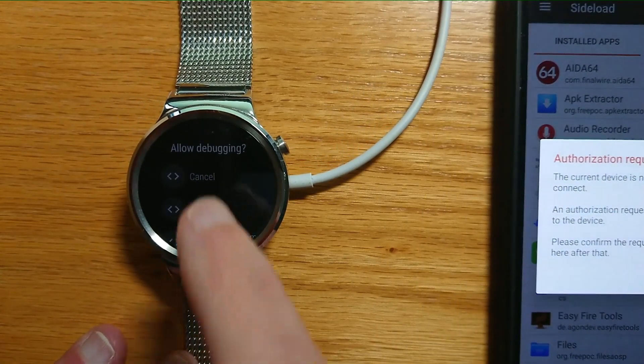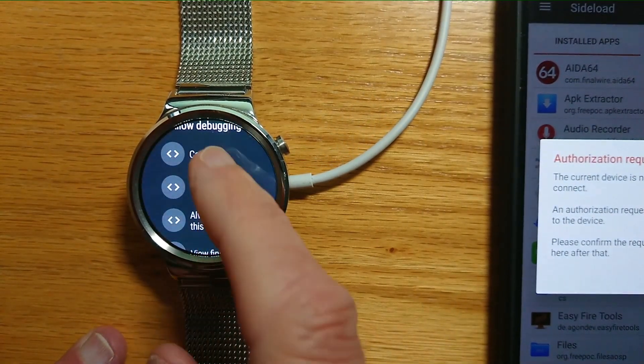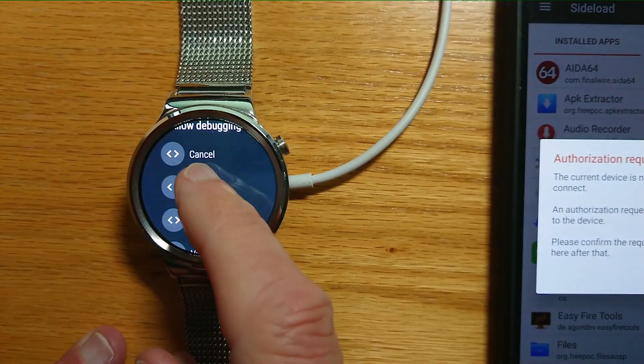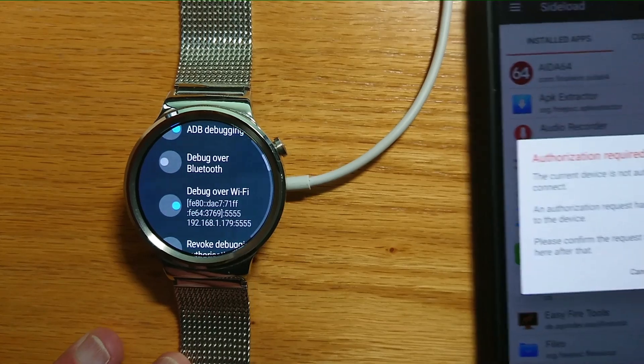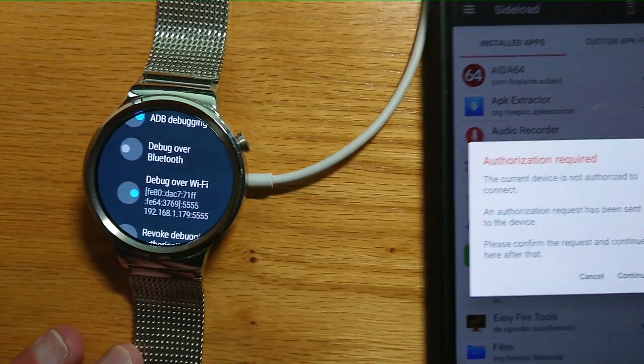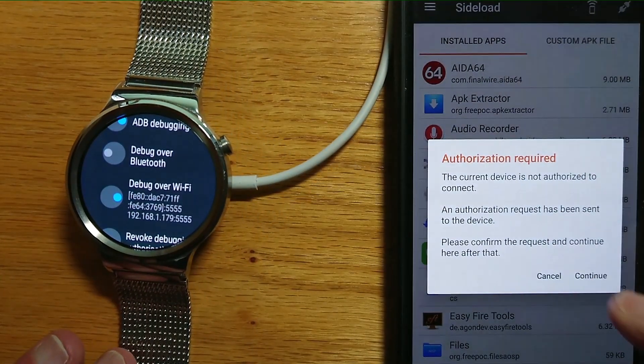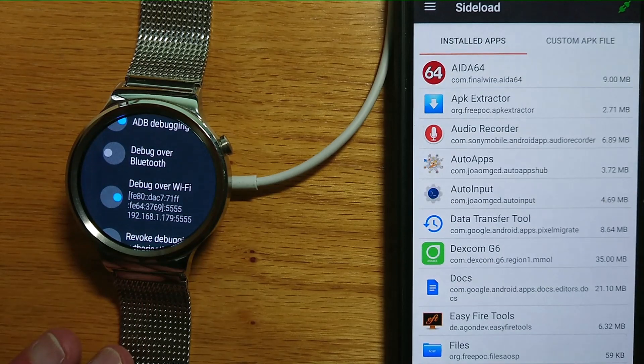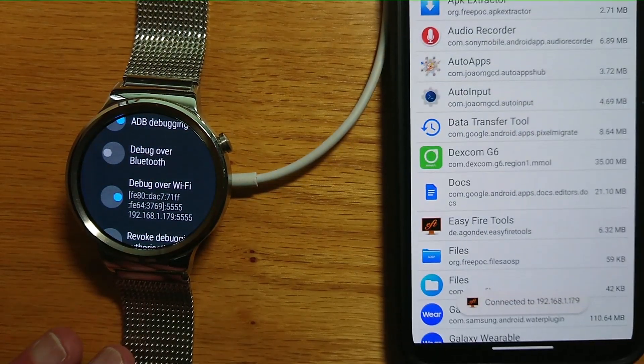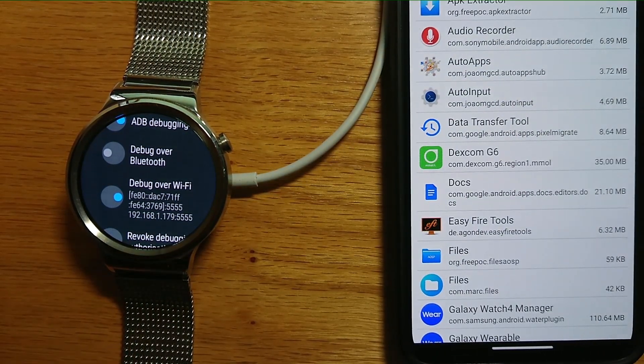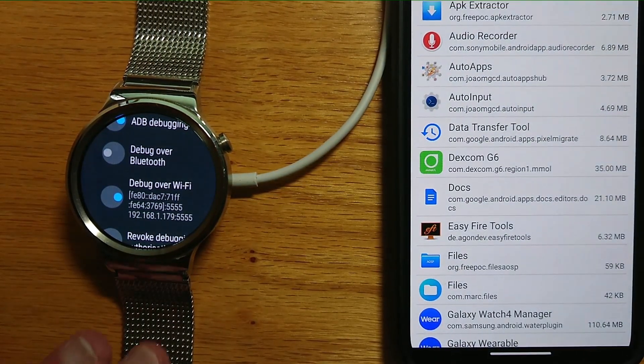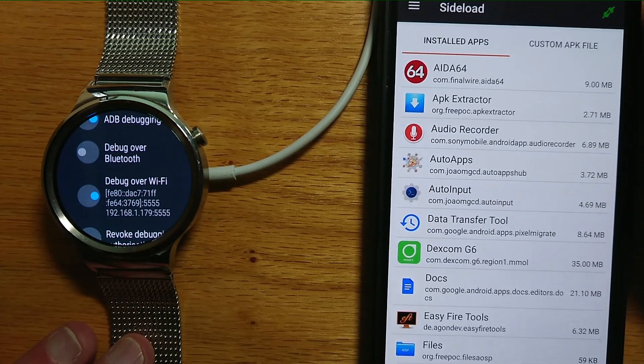Once again on the watch, let's say OK, and let's say Continue here. It's come up with a message to say the phone and watch are now connected.